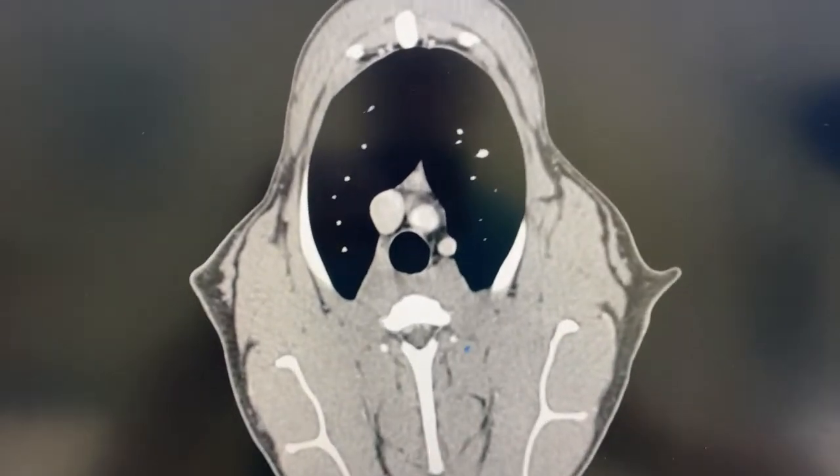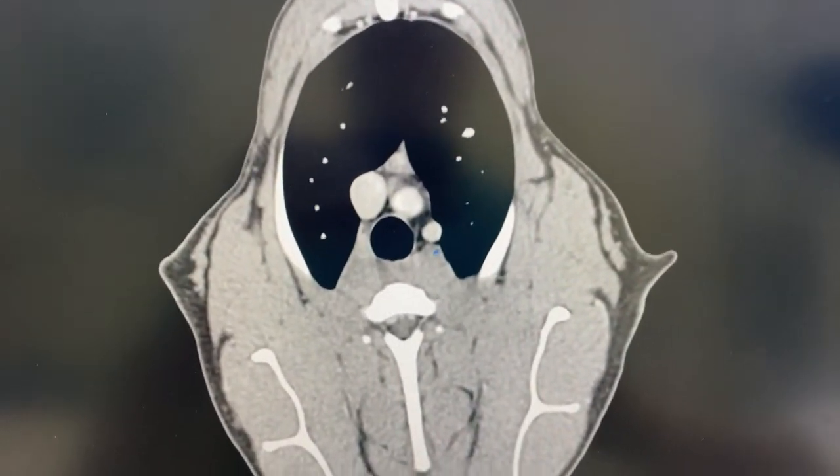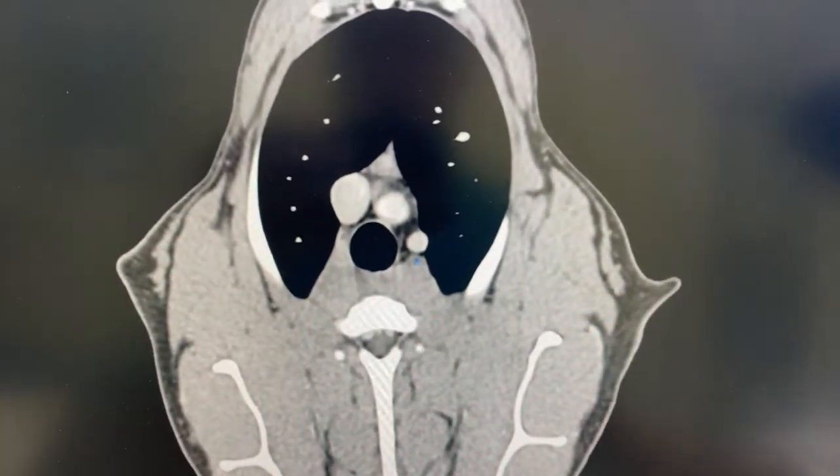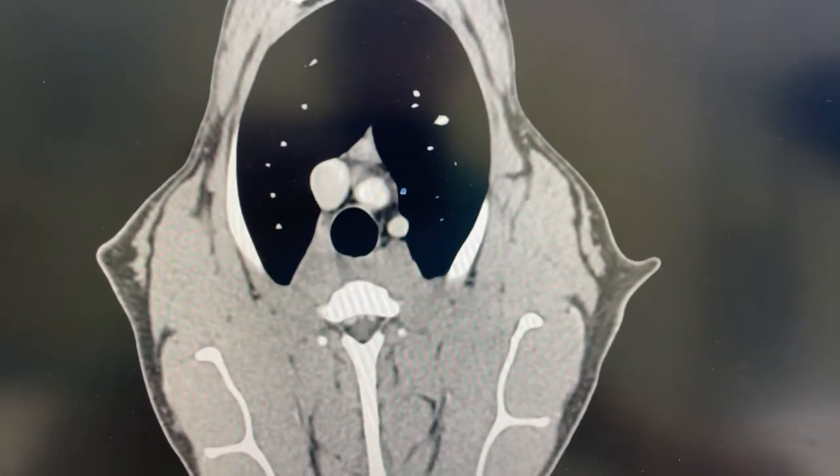Hi guys, this is Charles. I'm one of the surgeons at Southpaws. I've got a portosystemic shunt that I'm doing today, which is going to be a transjugular ligation using a stent and thrombogenic coils.